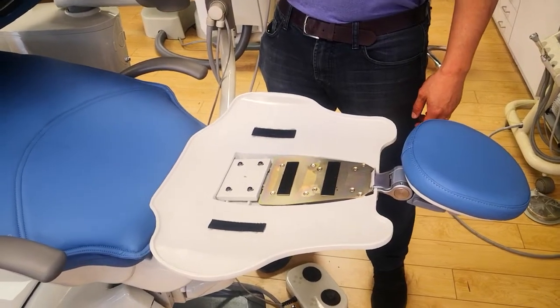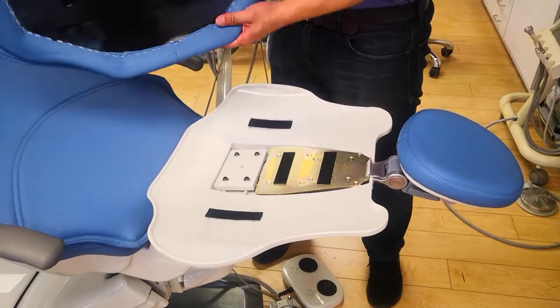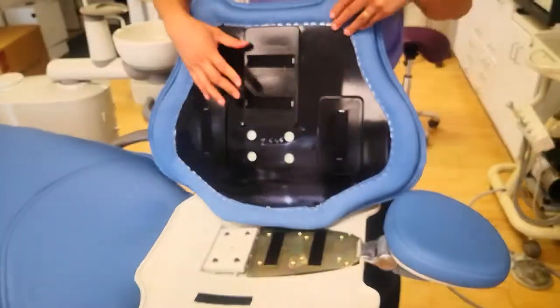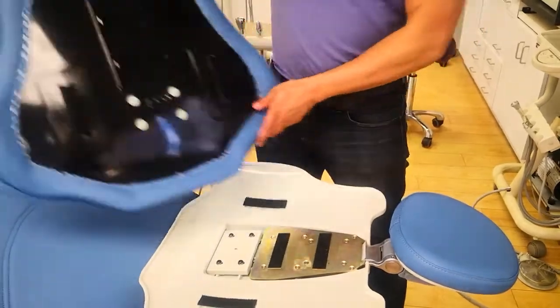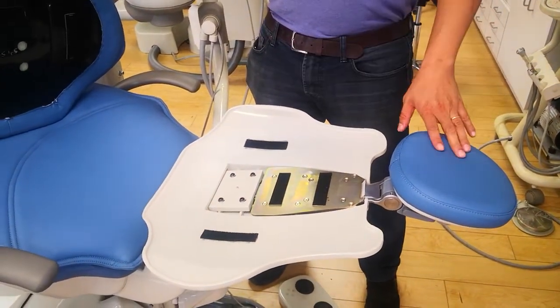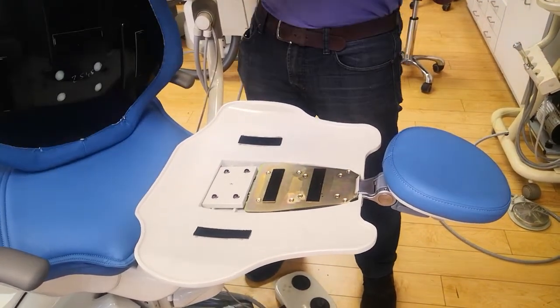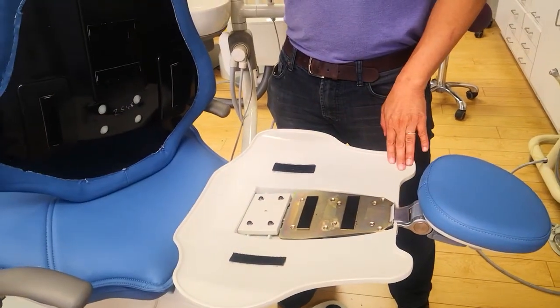I'm going to show you today how to put on an A6 or A12 backrest. The current backrest configuration has four velcros on the backrest. You want to make sure when you're doing it to first recline the chair back into the supine or flat position, so you can get leverage to push the backrest velcros onto the velcros on the metal plate.